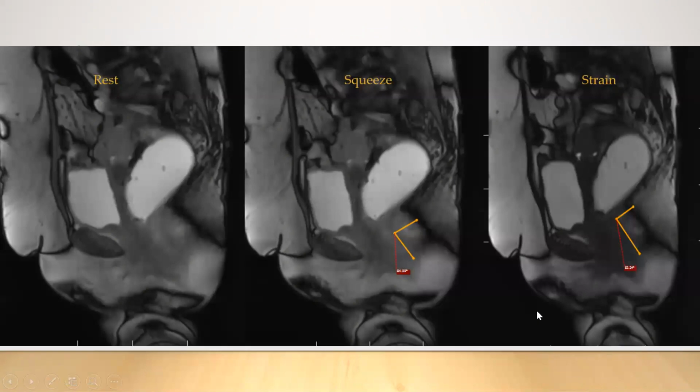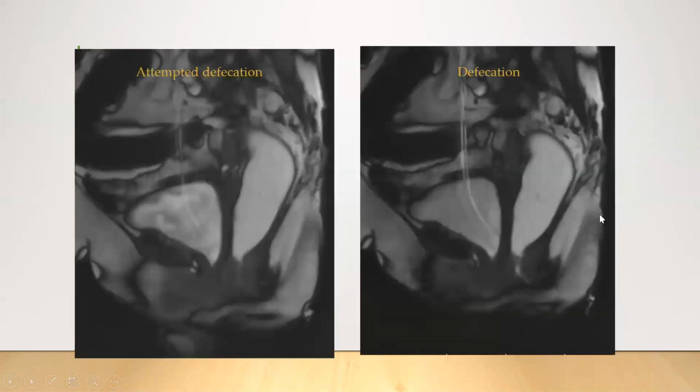So the same thing was evident to us in the form of an obstructive defecation, wherein you realize that at strain, the lumen is significantly narrowed out. You can appreciate the anorectal angle is still fairly acute, and the patient is struggling to defecate, but hardly any jelly could come out. Only when the patient really struggled for a much longer time, you could see a very small amount of trickling contrast coming over here. So basically, the stricture over here was responsible for the symptoms to happen.